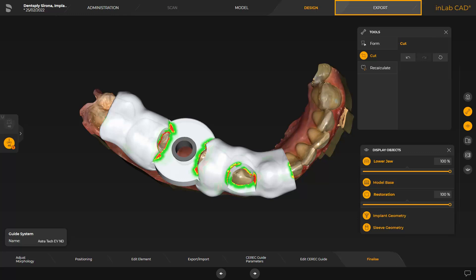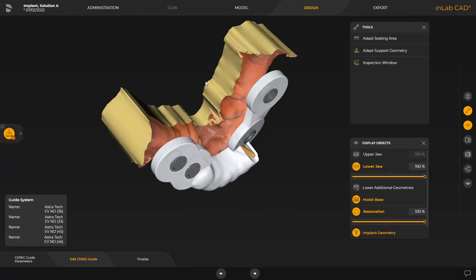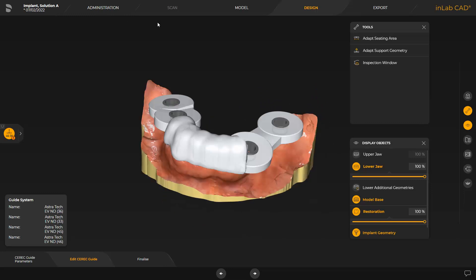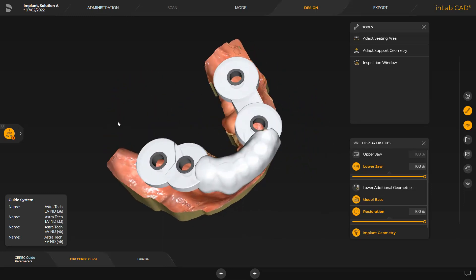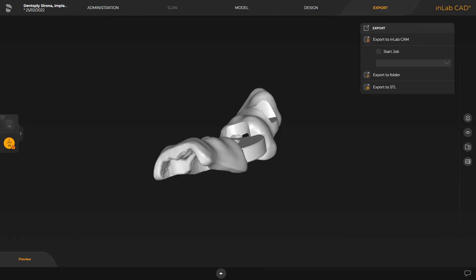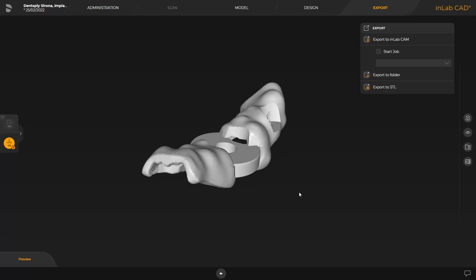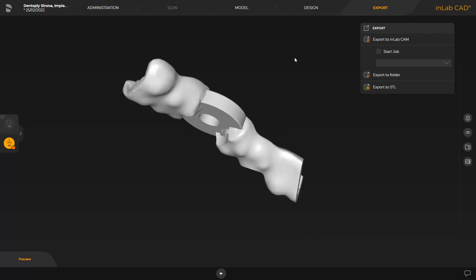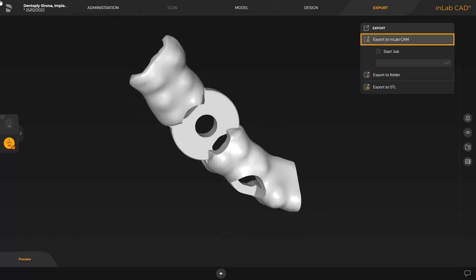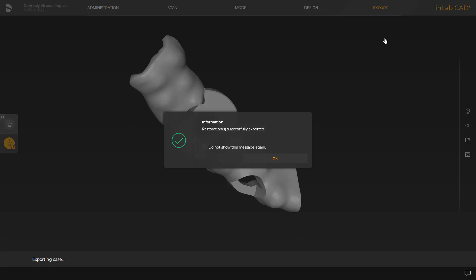Before moving to the last phase, the export phase, we will look at another CEREC guide case with multiple implant positions. This is a case involving a more complex implant planning with four implants in the lower jaw, which we showed at the beginning in the administration phase. The implants can either be printed with one surgical guide that serves for all implant positions, or you can design two surgical guides, for example. Now we proceed with our first case in the export phase.